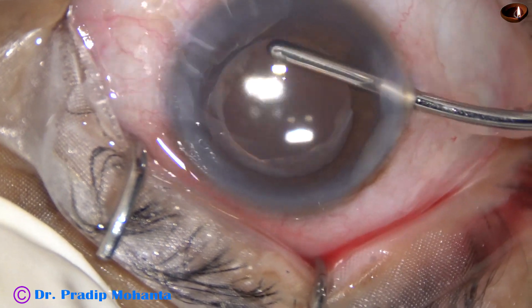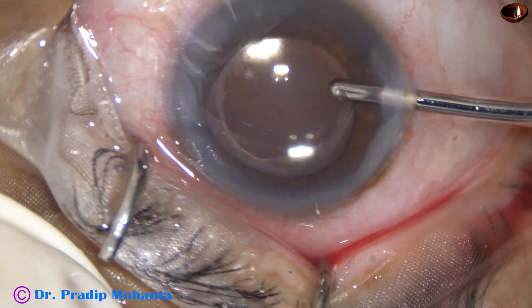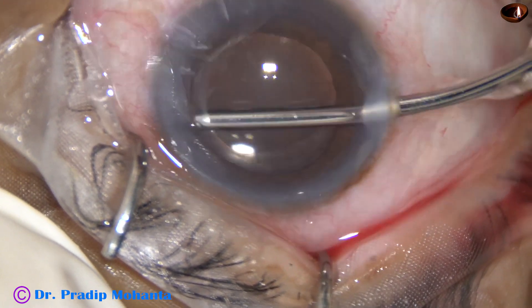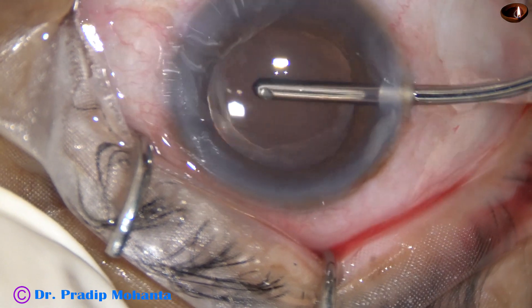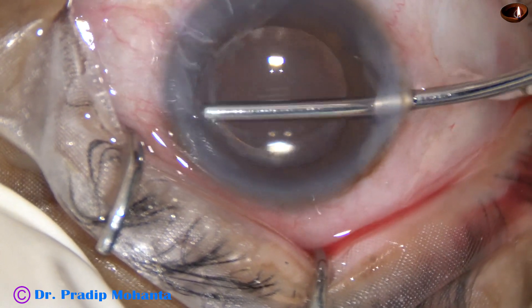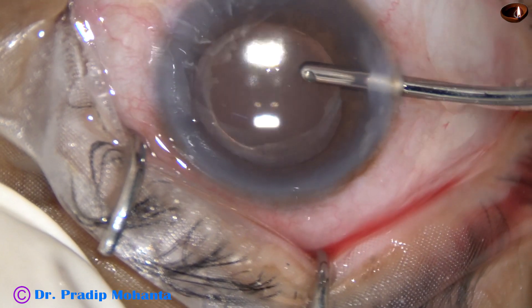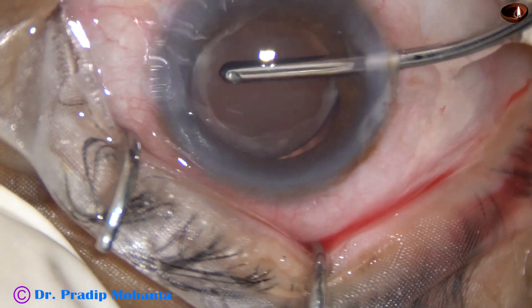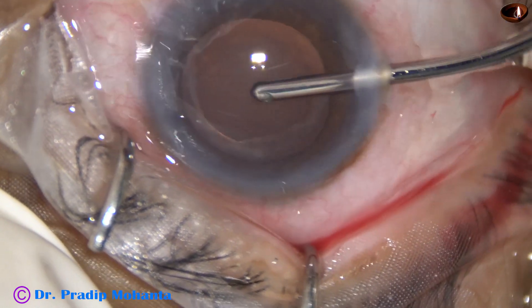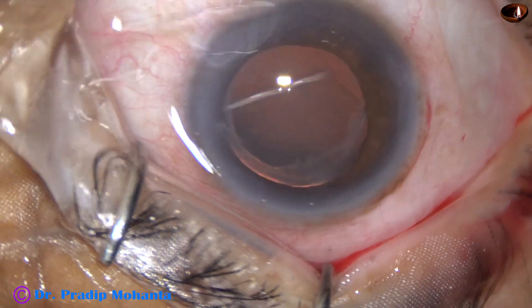The intraocular lens is mobilized and here I could go behind the anterior capsular rim and polish the undersurface of the anterior capsular rim. Some more fluid went behind the lens. There was no inflammatory membrane covering the posterior capsule.